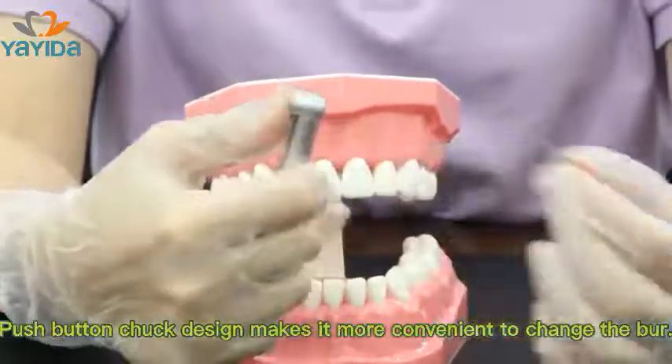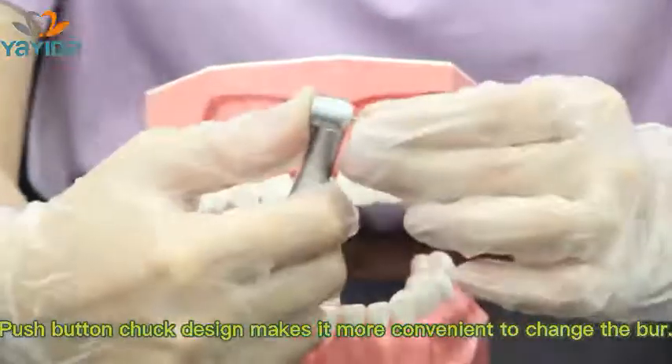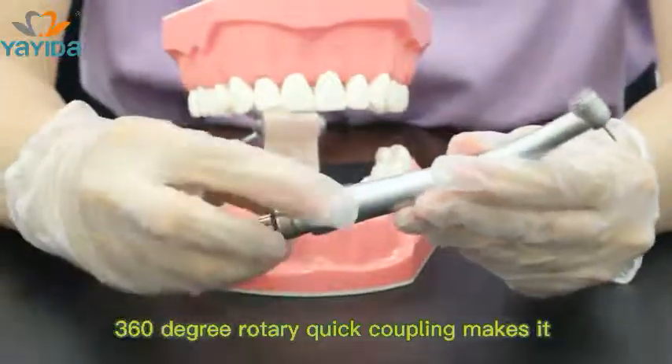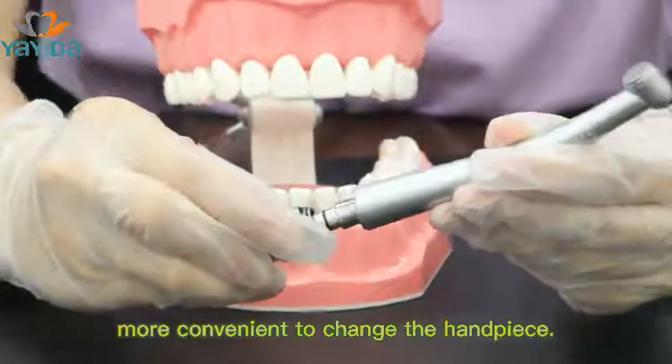The push-button chuck design makes it more convenient to change the bur. The 360-degree rotary quick coupling makes it more convenient to change the handpiece.